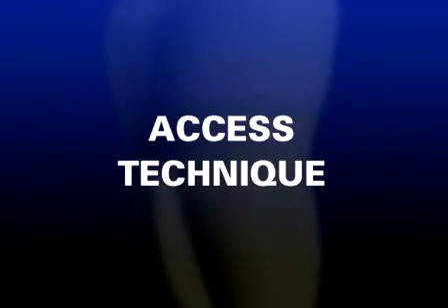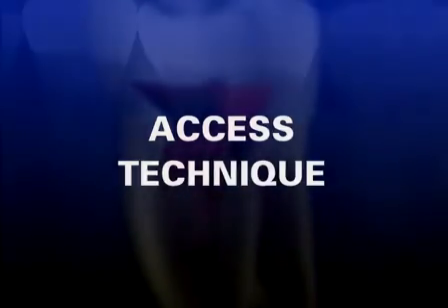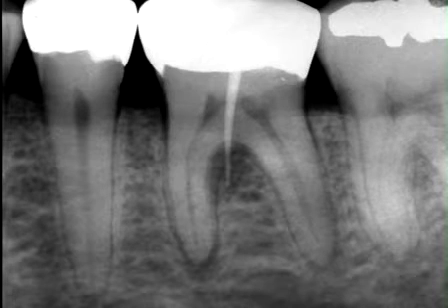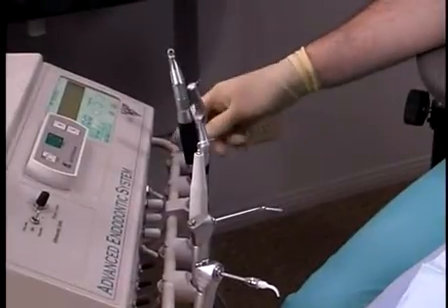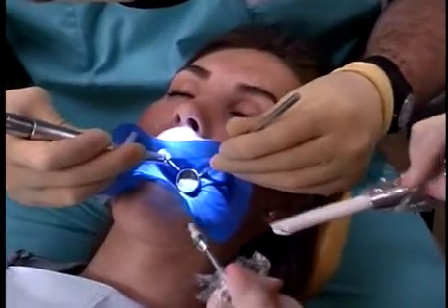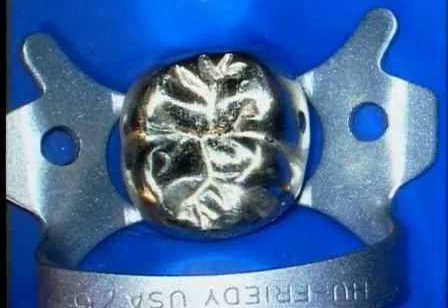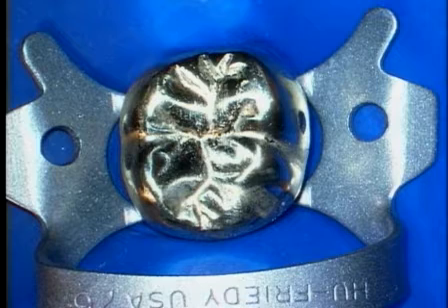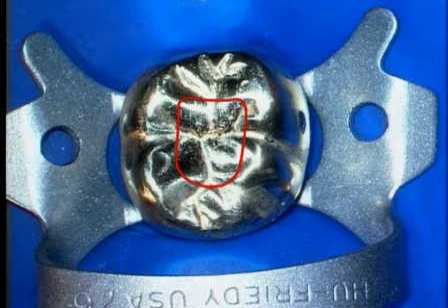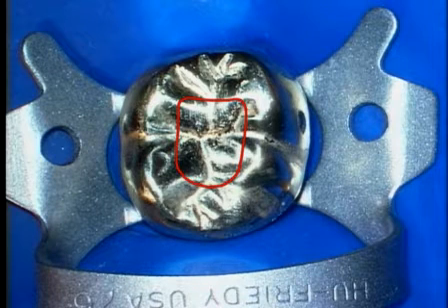Prior to cutting the access cavity, it's important to review our well-angulated preoperative films. We need to observe the relationship between the clinical crown and the underlying roots. We need to see if we can visualize the pulp chamber. And then within the pulp chamber, do we see stones? Great ergonomics and organization facilitate the flow of treatment and keep our patients more comfortable. Looking at the occlusal view of the isolated tooth reminds me of an old expression: start with the end in mind. The outline pattern can be used to guide our clinical actions.